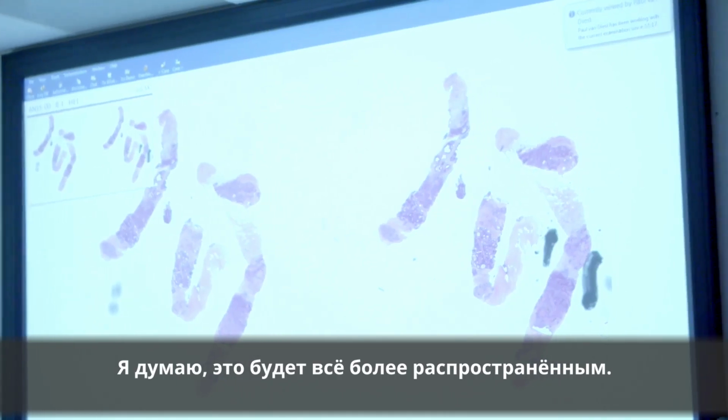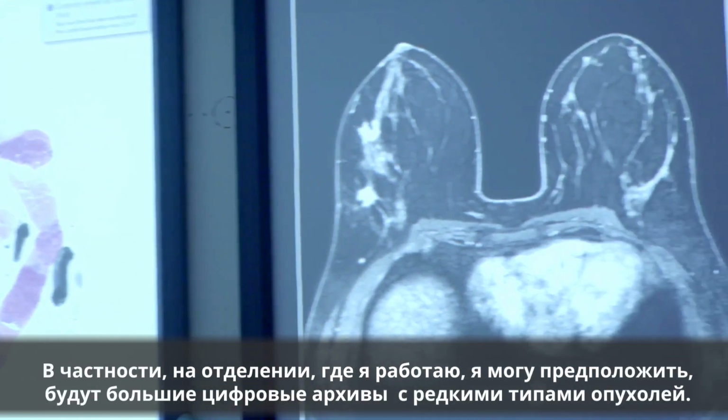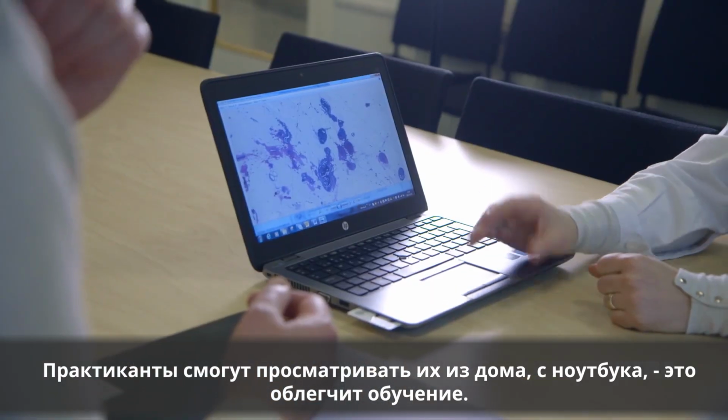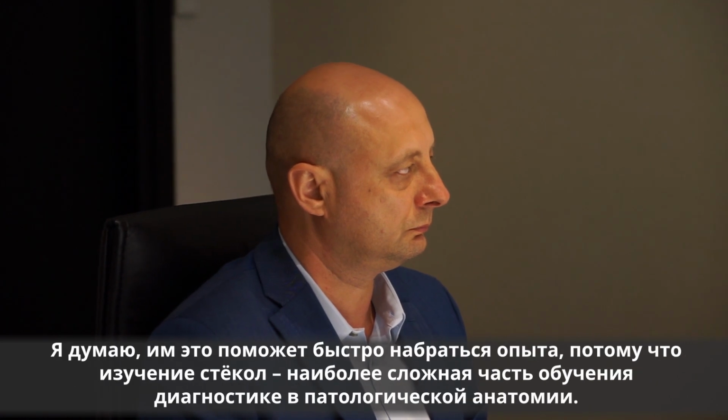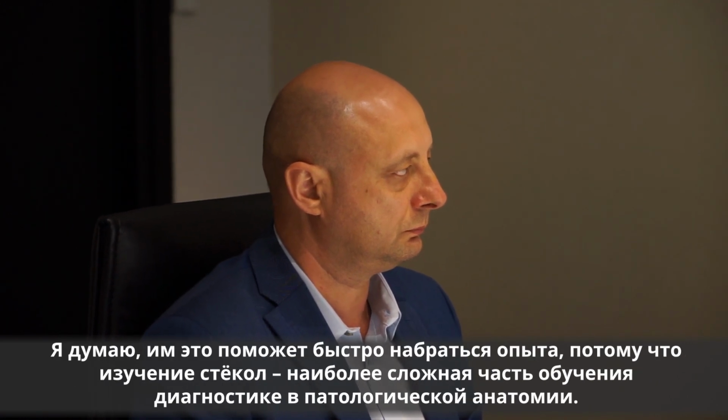And I think that will become much more widespread. Internally in our department, I could foresee large archives of, for example, rare tumor types, rare diagnostic categories, where the trainees could be reviewing them on their cell phone, on a laptop, from home, to aid in their education. And I think it could be a rapid way for them to gain that expertise, because slide review is the most critical part of training in diagnostic surgical pathology, and having a large library of whole slide imaging to do that makes a lot of sense.